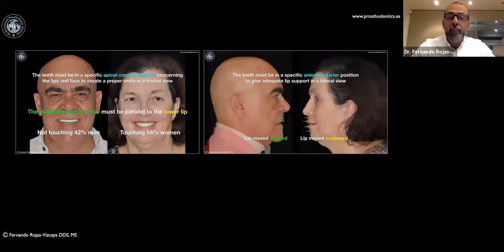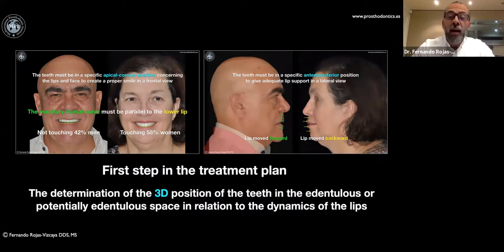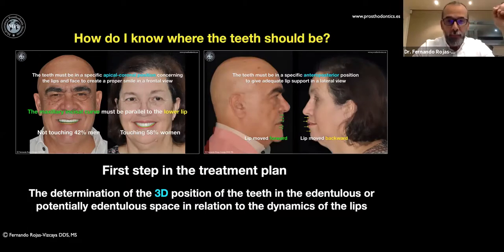So now you have the case. Now at least you know how the patient looks. You can show a picture to the patient and say, take a look. This is how you will finish after I make everything. So this is the first step. Find the 3D position of the new teeth in the edentulous space or in the potential area to place implants. But how do I know where these teeth will be? And why is it important? Because the teeth will be the guide to determine what I need to do with the sinus, with the graft, with the alveolar bone, if I need to add bone, or maybe I need to cut bone, or maybe I need to add a pink prosthetic area.